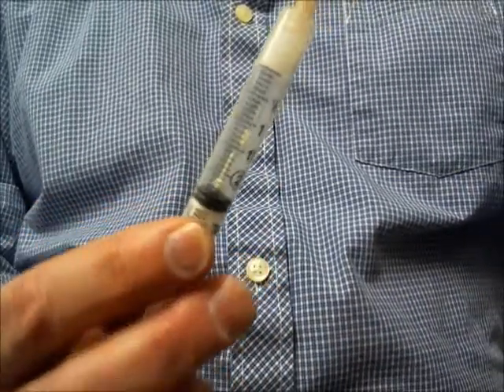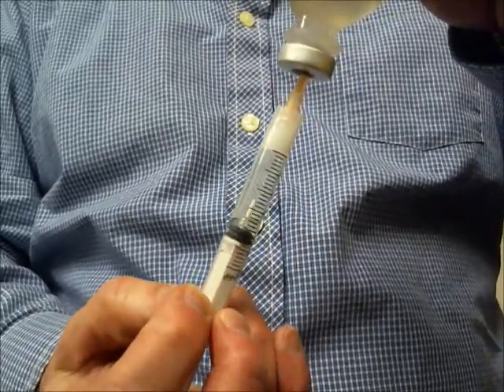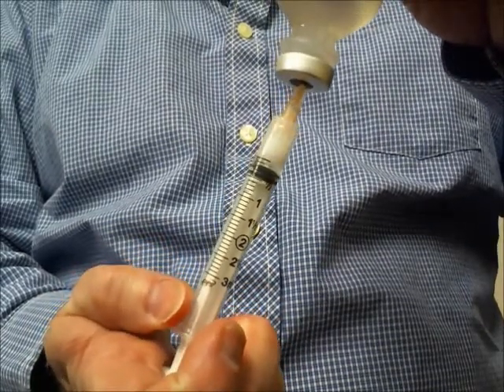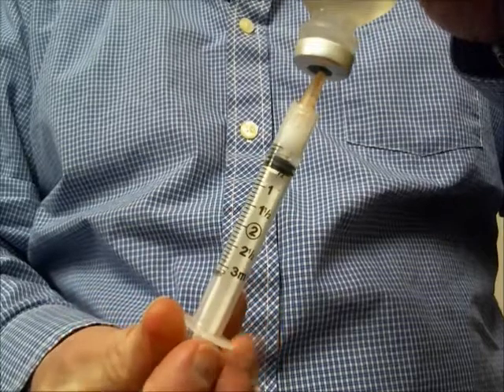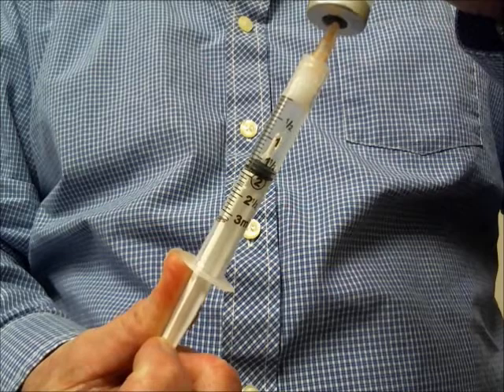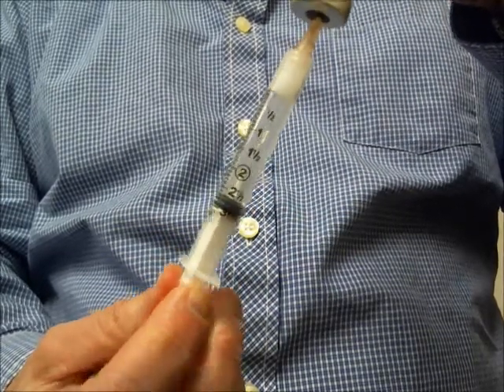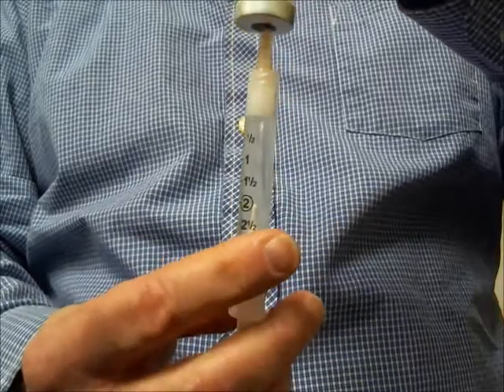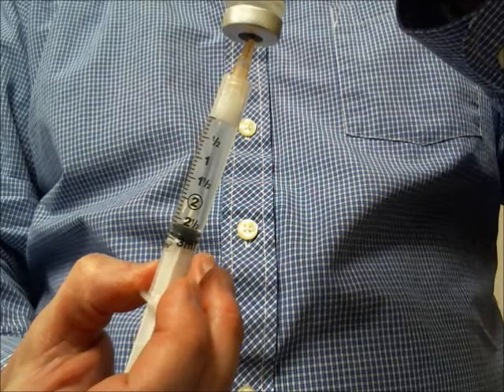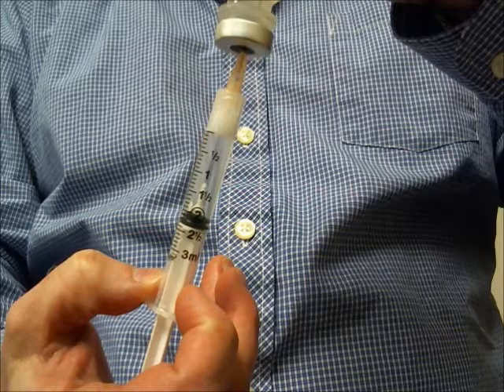Now, as I go into the vial, I push out that displacement air, being very careful not to push the plunger all the way down. And this is where I draw in more fluid than what I really need. Now I have extra fluid — tap out any air bubbles, and get right to my 2 cc target point, and I am properly dosed.